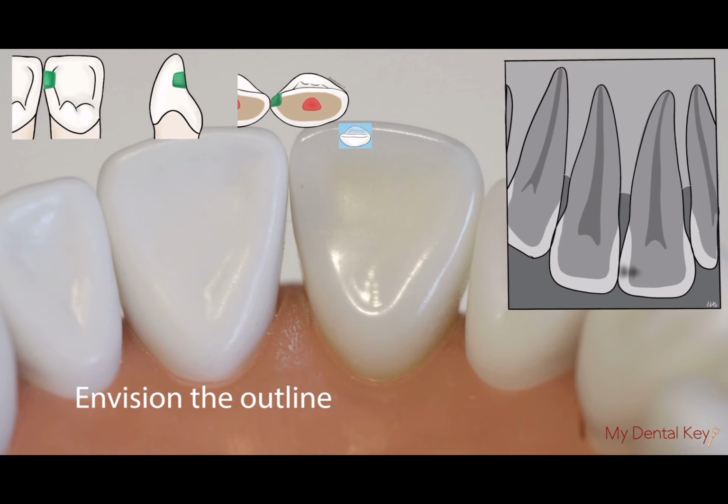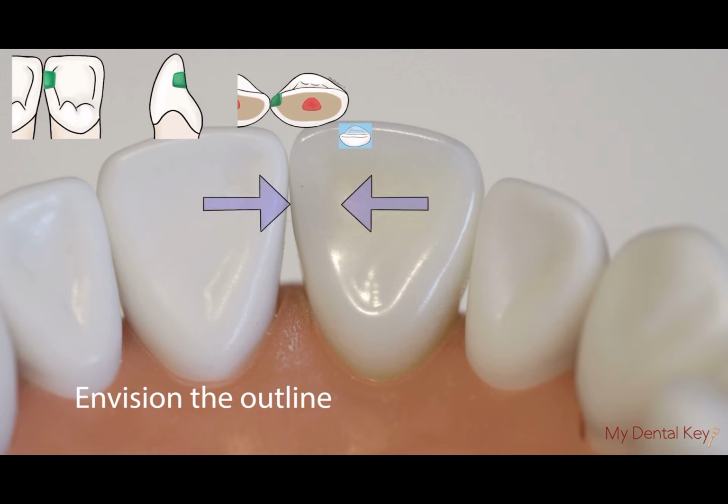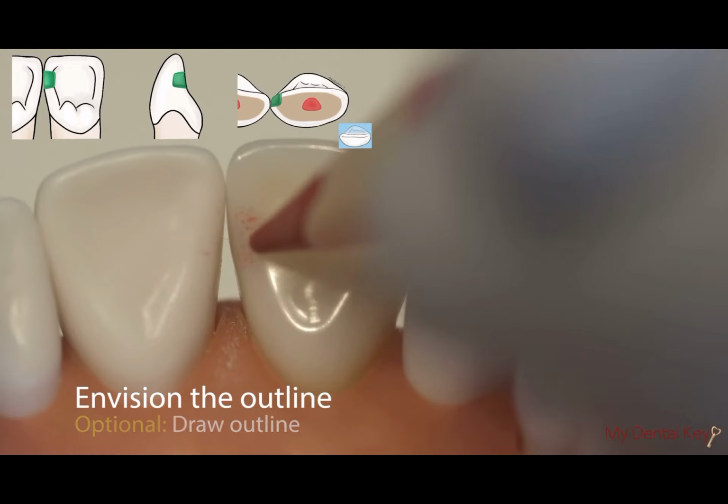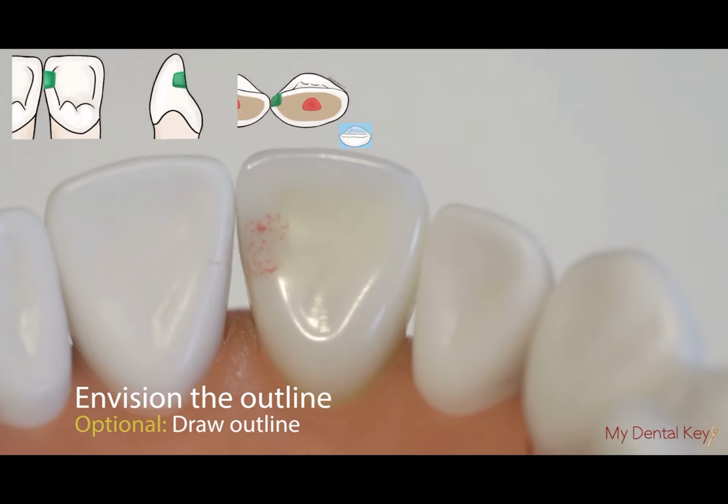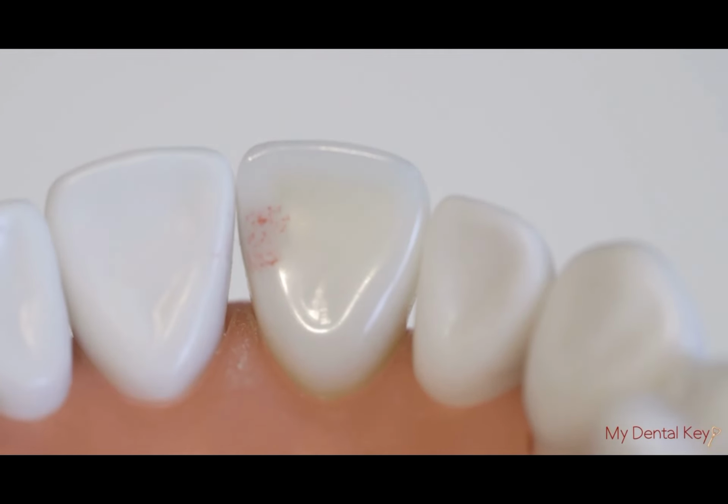During the exam day, you will receive a radiograph to indicate where your carious lesion will be located. You can also envision the outline of the caries on the tooth because of the shading. Optionally, you can use the red and blue pencil to draw the outline of the cavity preparation on the tooth.